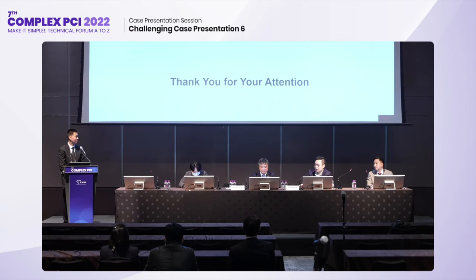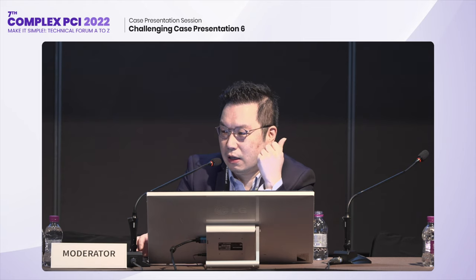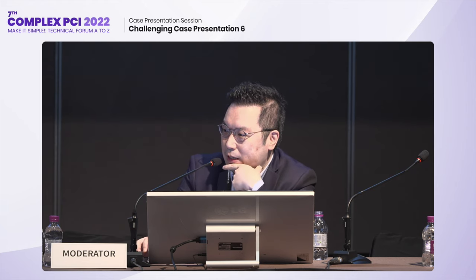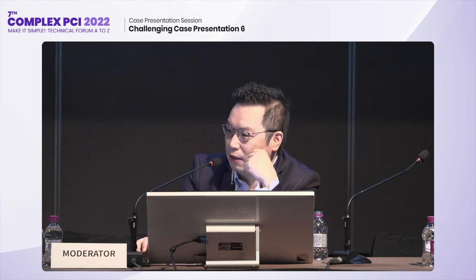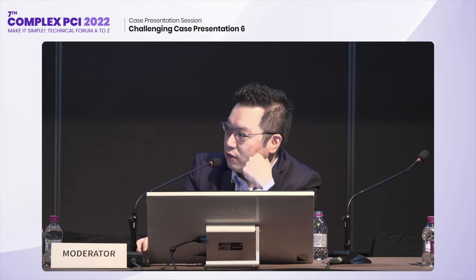just because we cannot predict what happened. Just like in your case, you cannot predict whether there is an abrupt closure of the other vessel. So perhaps after the first cardiac arrest, if the vessel is not that urgent to be treated, you just spend a few more minutes to put in the IABP, or in some centers, maybe a more advanced device like an Impella. Putting in some sort of mechanical support upfront will make you feel a little bit more relaxed or safe during the rest of the procedure.